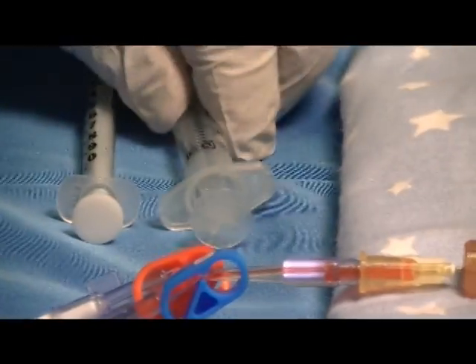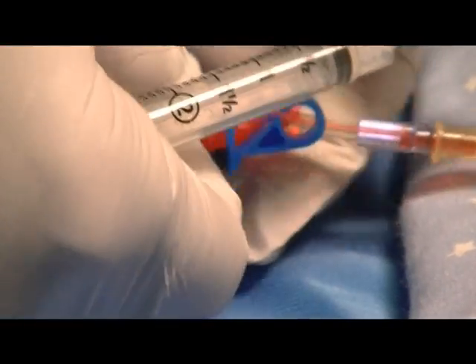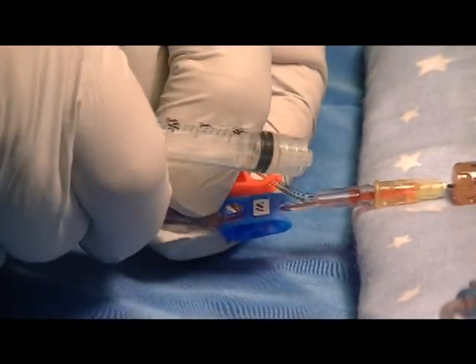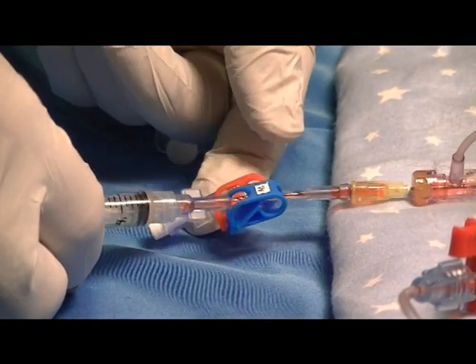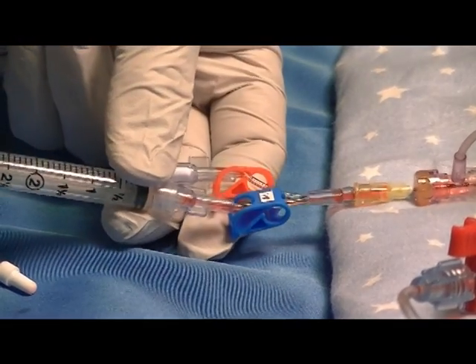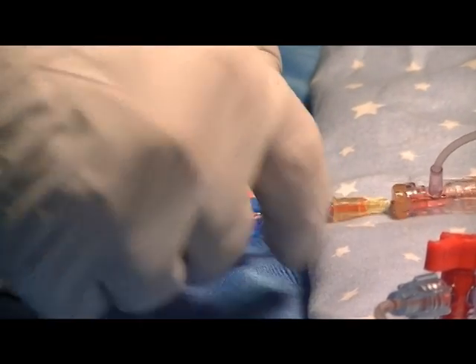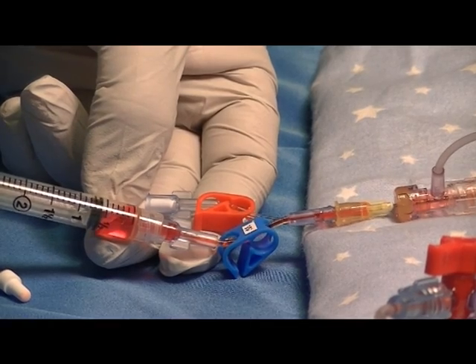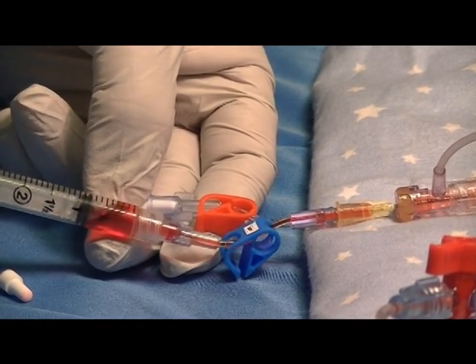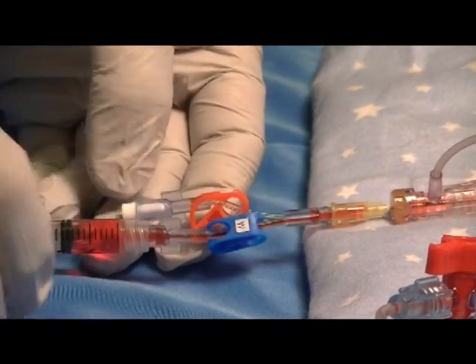Re-clamp the waist clamp and attach the 3 ml aspirating syringe to the waist side. Unclamp the clamp and draw 0.5 ml of clearance blood into the waist syringe. Re-clamp the clamp and leave that waist syringe in place.